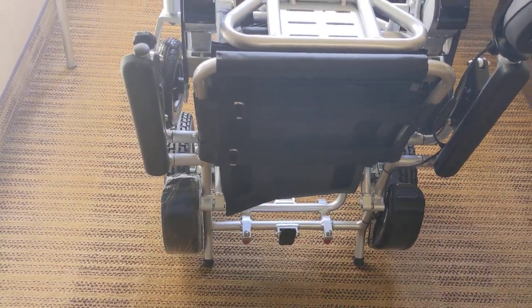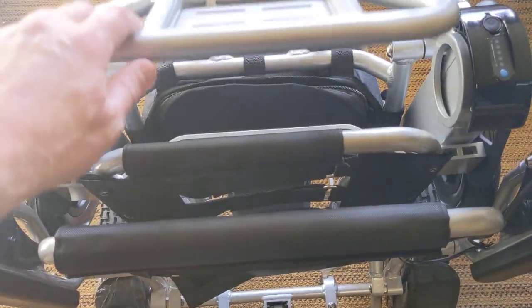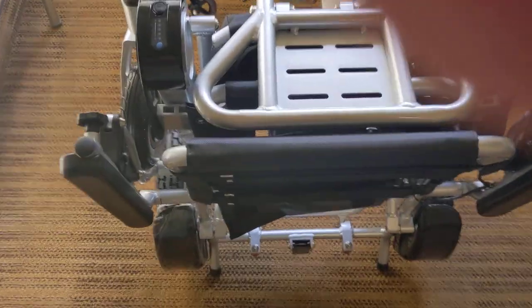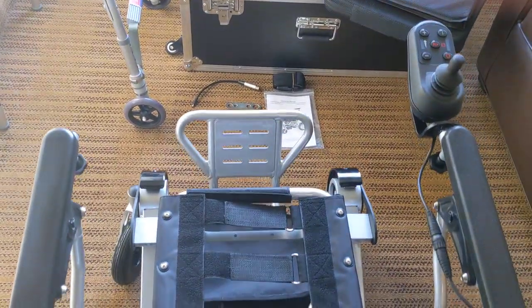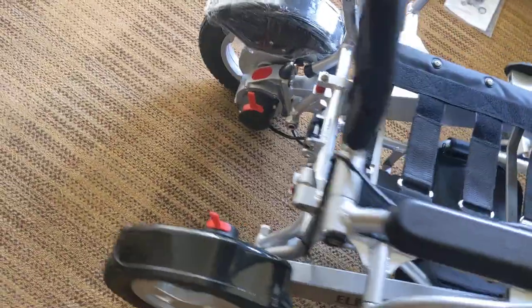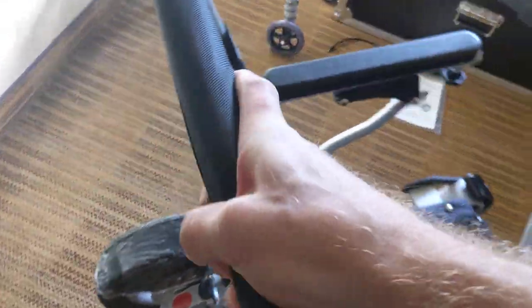This chair is probably our most popular chair, for many reasons. Let's go ahead and unfold it. You can see that I unfolded it just with one hand. It is in freewheel mode, very easy to maneuver with one hand.